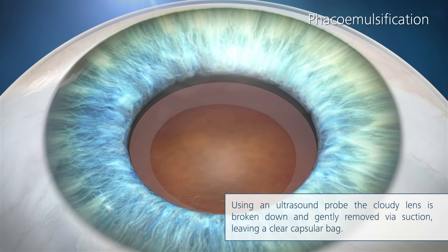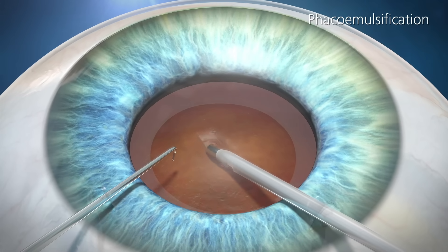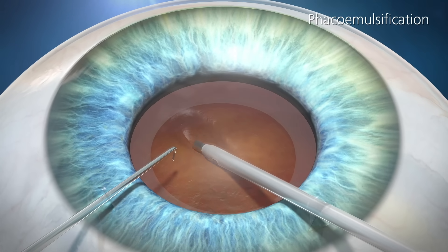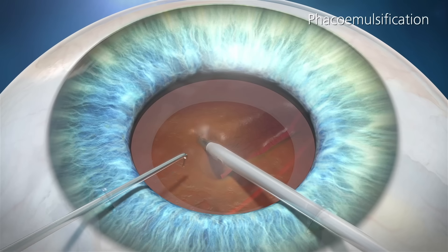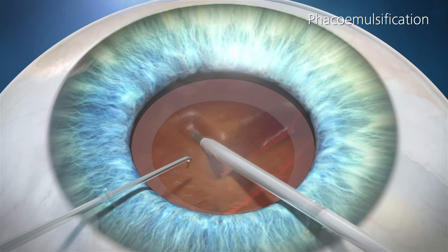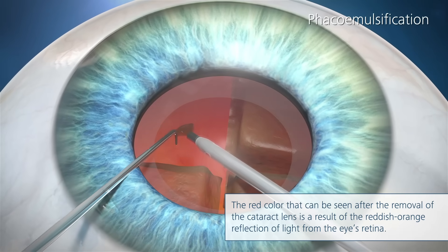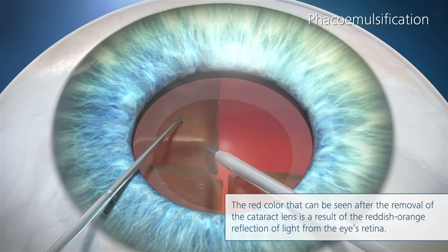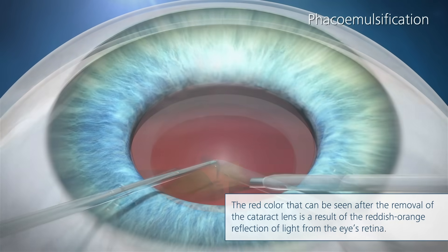Using an ultrasound probe, the cloudy lens is broken down and gently removed via suction, leaving a clear capsular bag. The red color that can be seen after the removal of the cataract lens is a result of the reddish-orange reflection of light from the eye's retina.